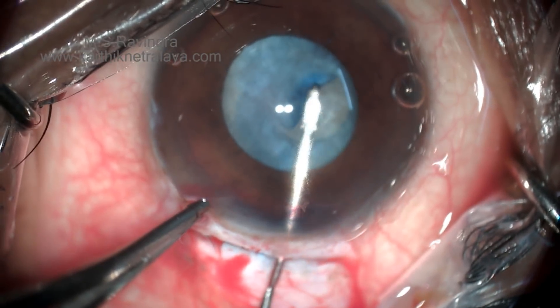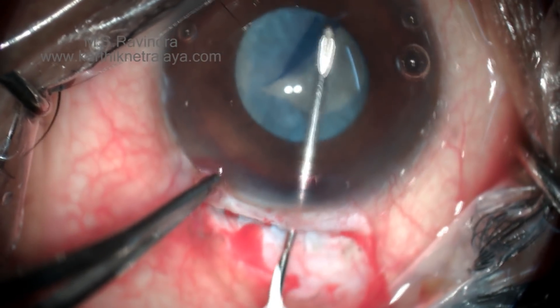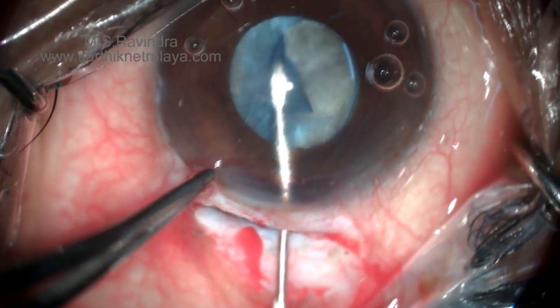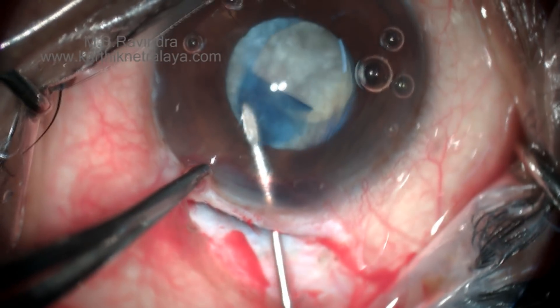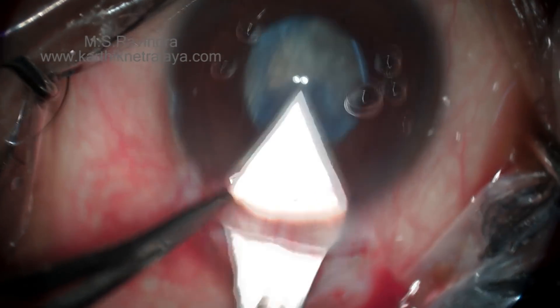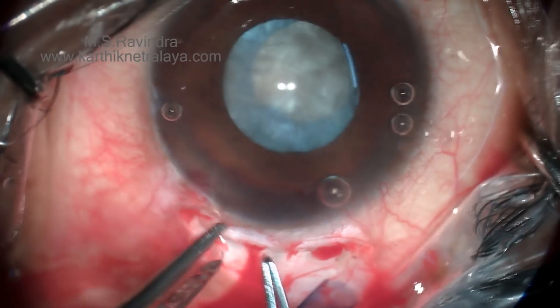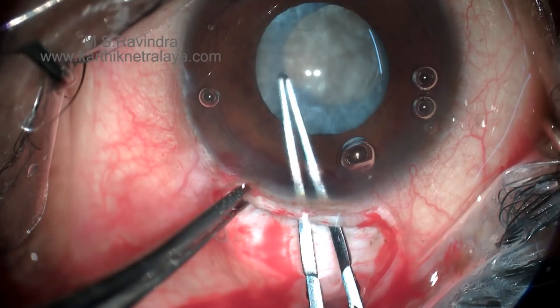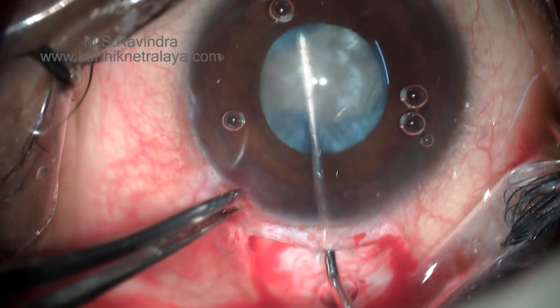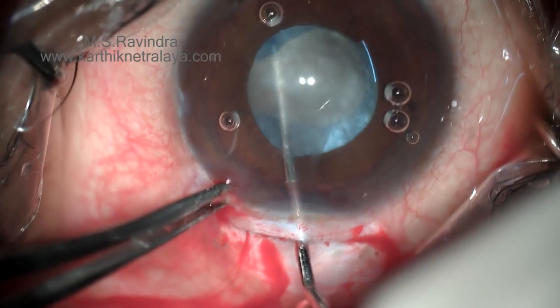Here, though there is no loss of anterior chamber, it is tough to complete the rhexis in one go. There is some visco loss and the anterior chamber is shallowing. A small rhexis is achieved. The internal opening of the tunnel is enlarged. A small capsular flap was created; this is identified and removed completely so that it does not adhere to the periphery.